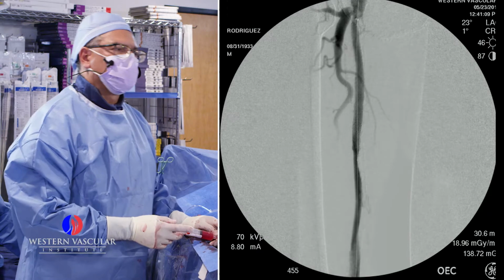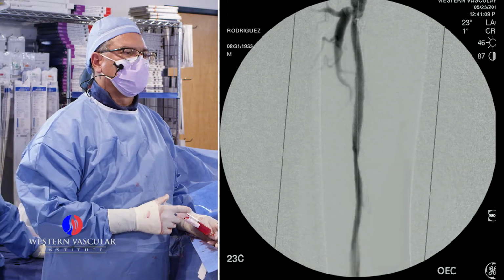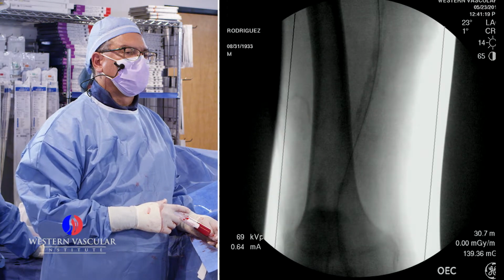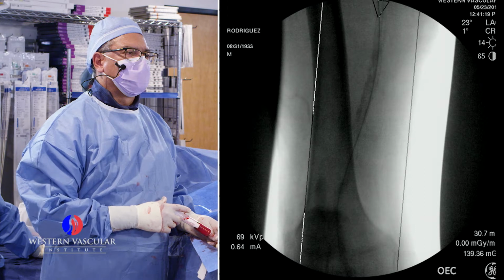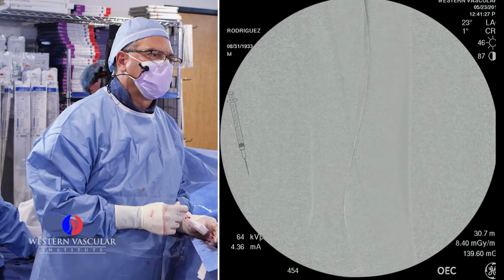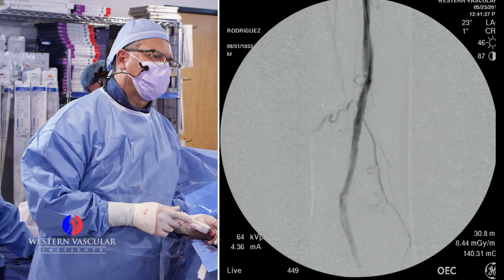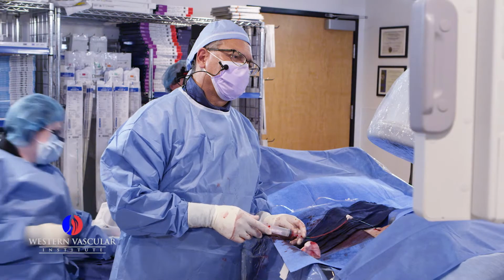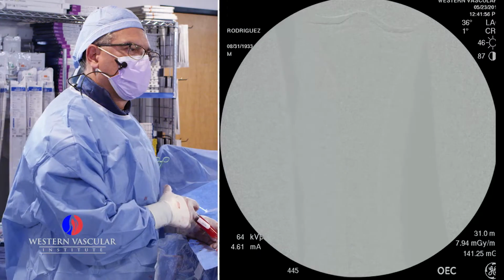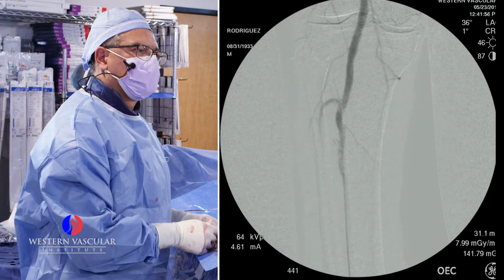All right, next one. Here we go. Let's do one below the knee also. Good.